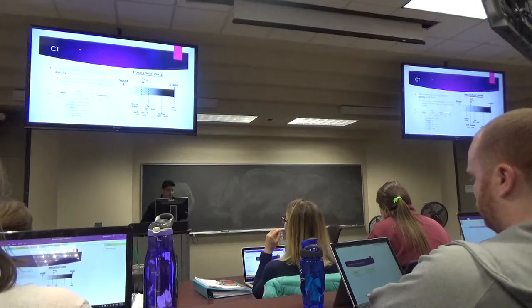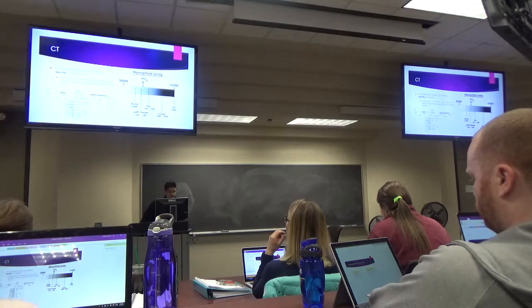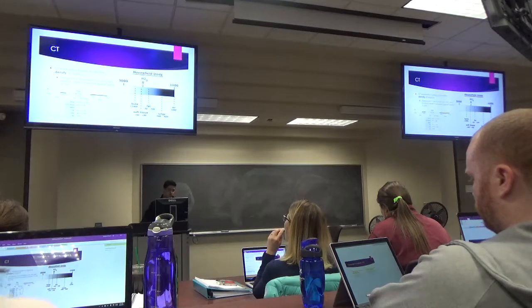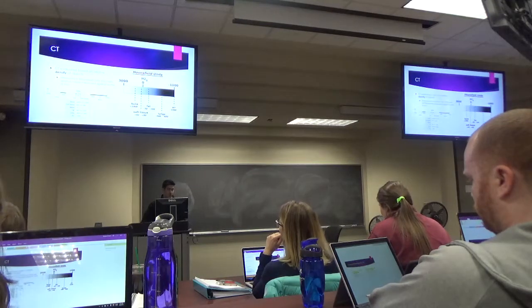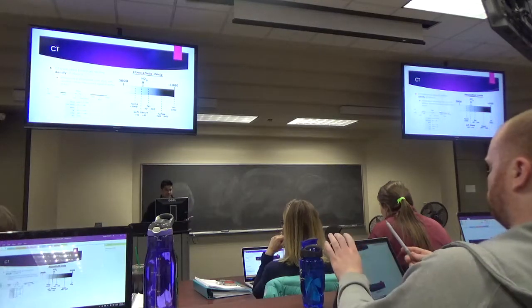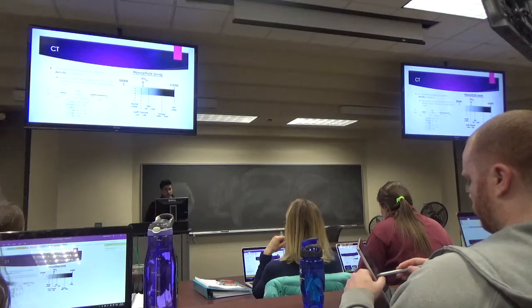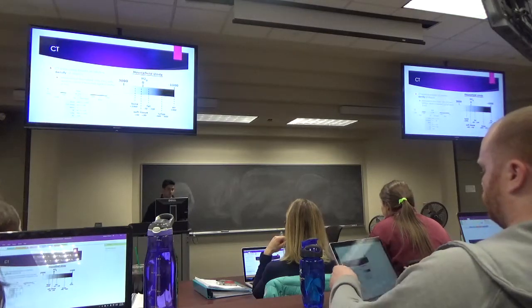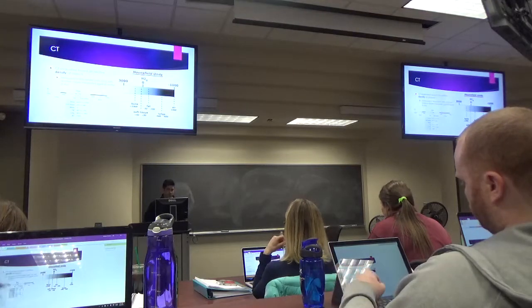So when we talk about CT, again, we talk about in terms of relative density of objects. We measure in Hounsfield units with relative values measured against water. All you need to know is just really what I've quoted here, is that when we talk about CT, we talk about its density. So again, X-rays, plain film, and CT, its density. And then when we talk about ultrasound, it's reflectivity, and we refer to that as echogenicity.